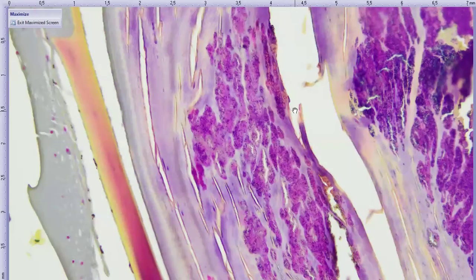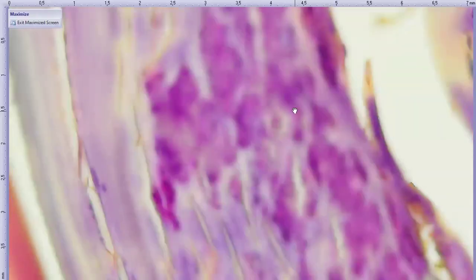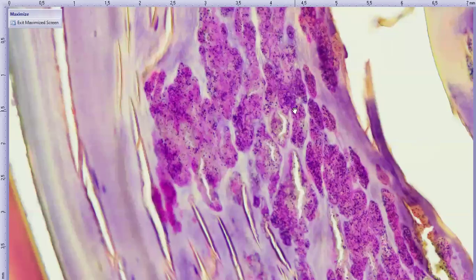So I think Dr. Klymans was onto something when she suggested that perhaps not all of these bacteria were viable anymore. And that might be why they looked a little bit weird on H&E and are not staining diffusely similarly on the gram stain.